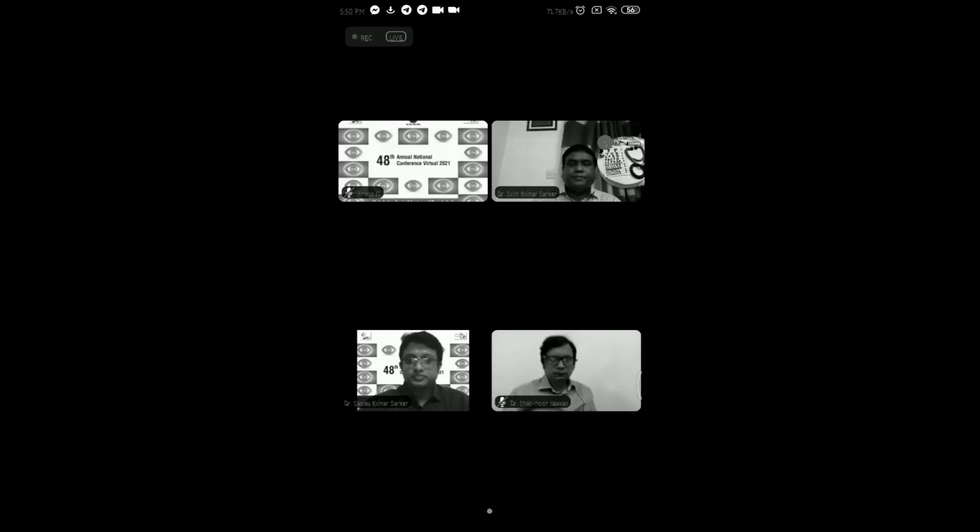Thank you, Dr. Sanjoy, and thanks to everybody who has spoken in this session. Actually, it's an OSB presentation, so I thought that it should be very basic, and what the speakers say, they are absolutely very successful in their talk. Regarding OCT, I would like to mention one thing that Dr. Shohid mentioned very rightly, that we see the line scan only. Once we see only the line scan, it's very difficult. There are opportunities to miss many things.